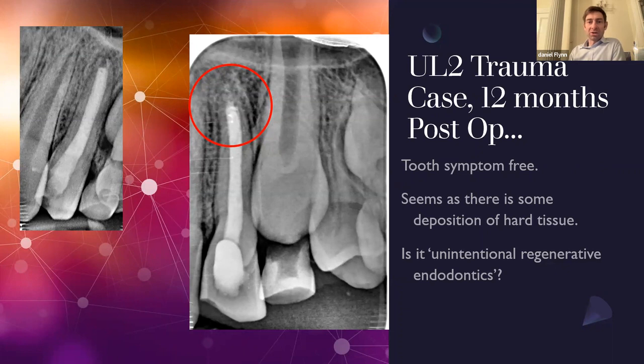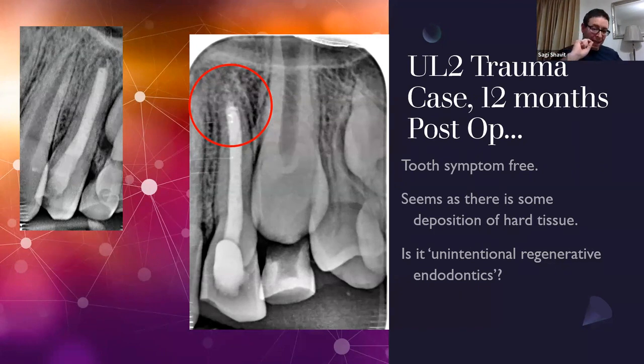So there's another one. Will it not be hard for retreatment if this is only bioceramic sealer? So, when you put bioceramic sealer, you say goodbye to retreatment. Is it non-retreatable? The answer is no. It is retreatable. If you take ultrasonics, you can break the whole thing into bits, flush them away. But those cases, you've done the best you can. There's no point in going back non-surgically. The answer is yes, they are retreatable, but there's no point in doing that. Just go straight for surgery.